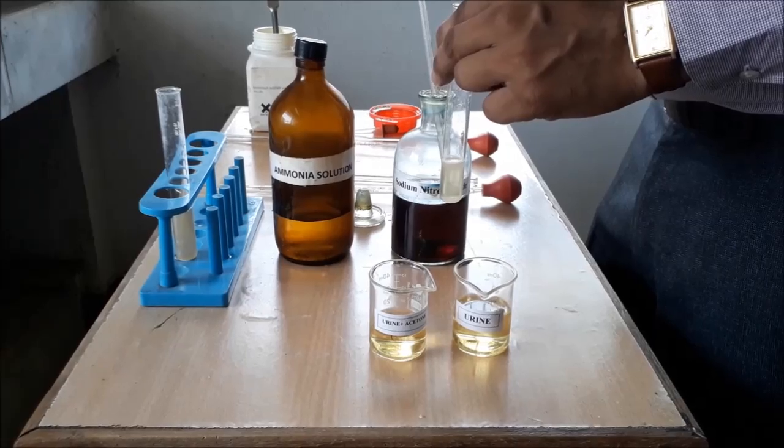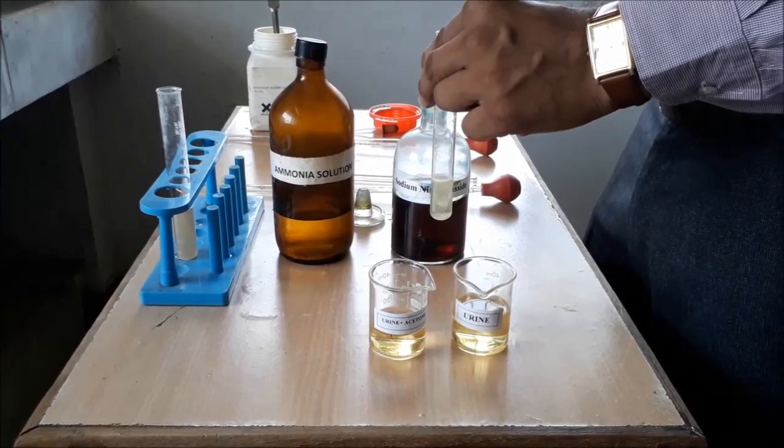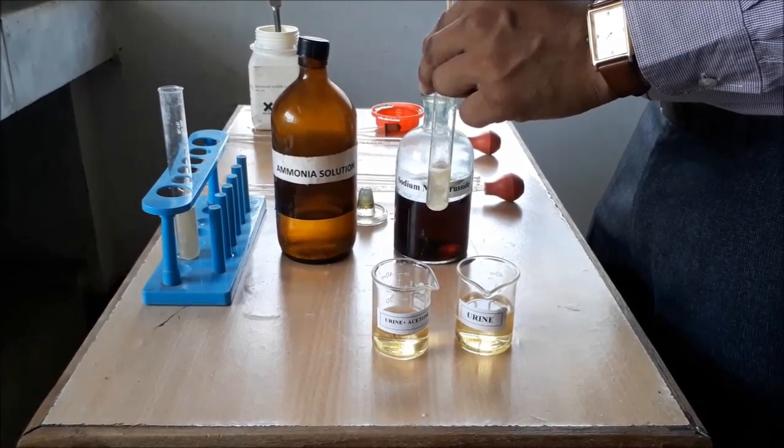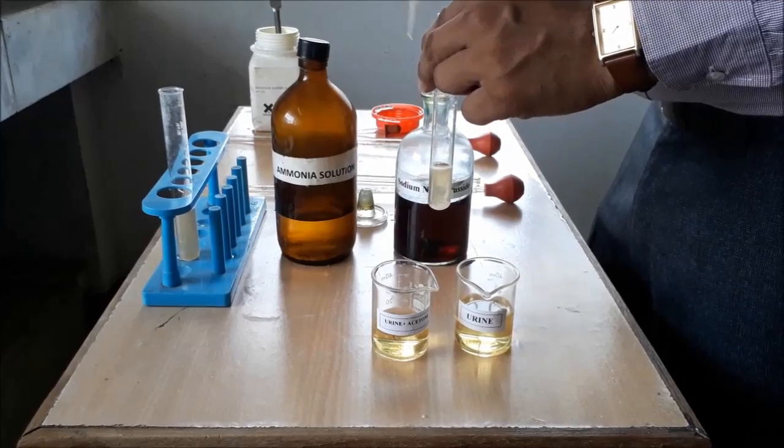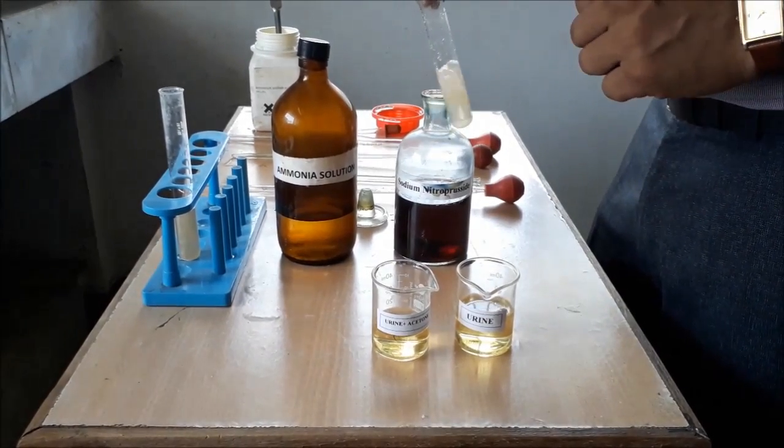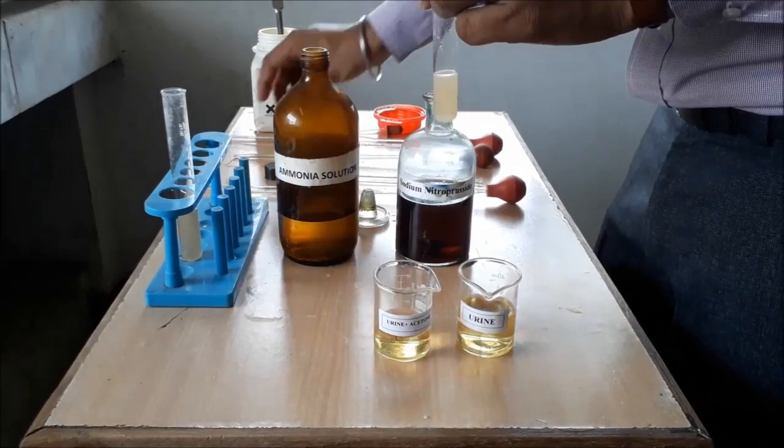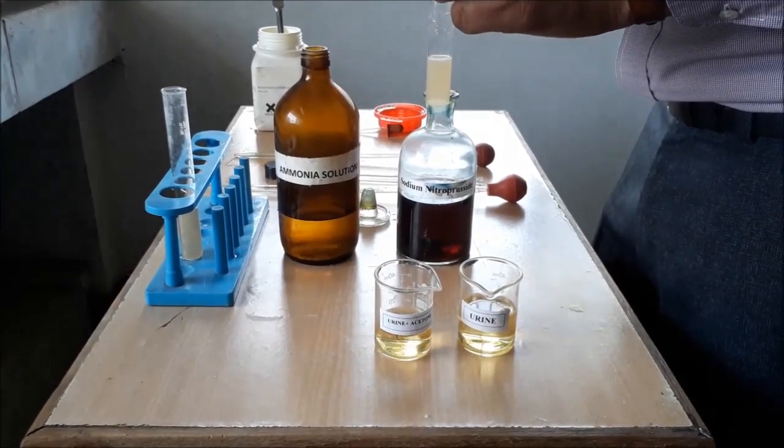Now, we are adding 2 drops of sodium nitroprusside with the help of pipette from the wall of test tube. After adding drops of sodium nitroprusside, we have to shake it a little bit.